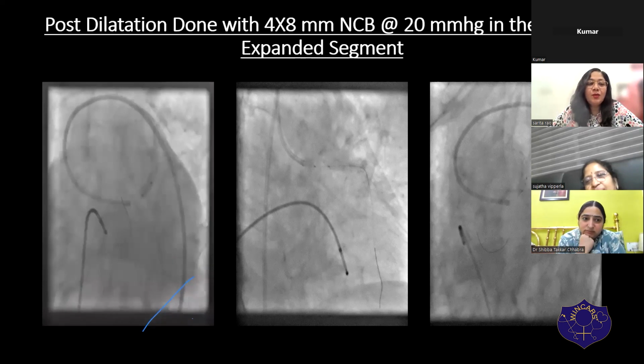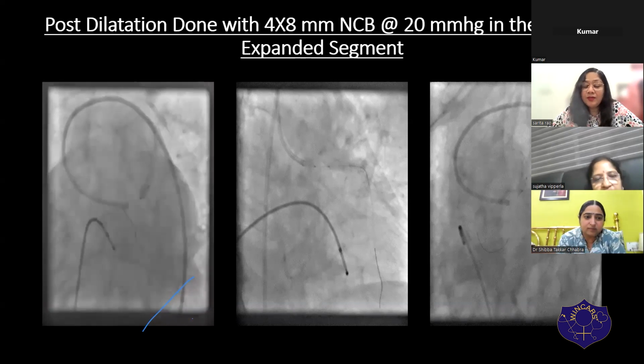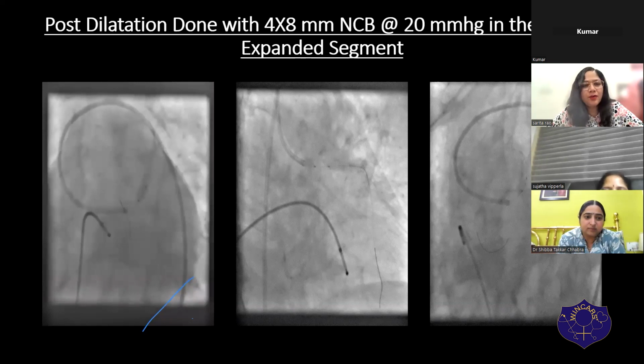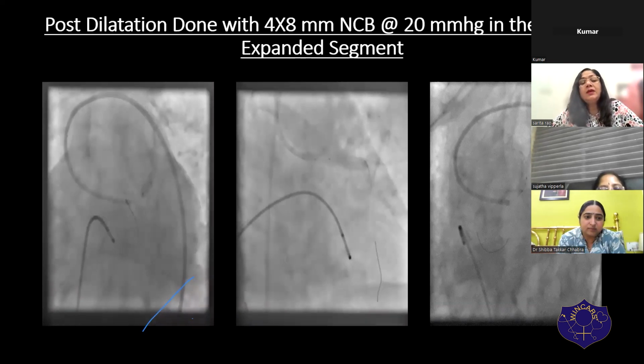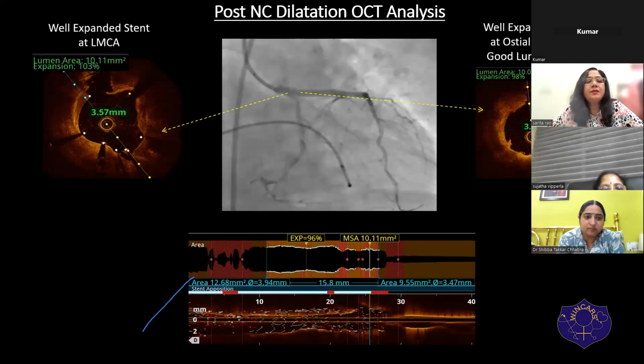I would definitely prefer to stent from left main to LAD. Okay. So that's another viewpoint, another choice which you have. You can do that. But for me, it was a dominant circumflex. I did not want to. And I found a landing zone, so I didn't. And then we took in a balloon and we dilated.